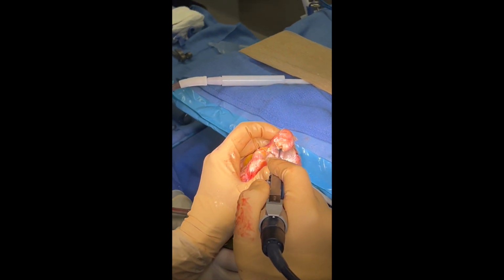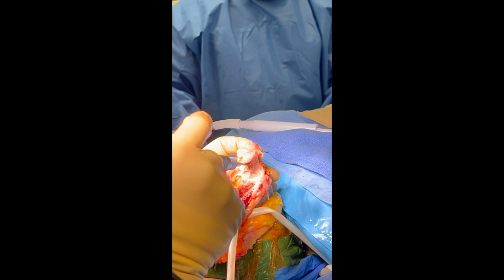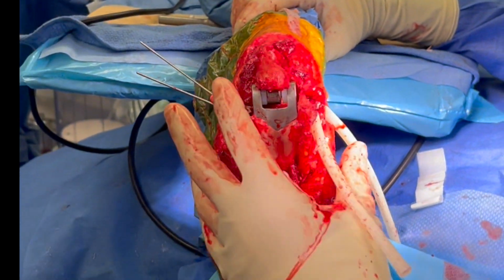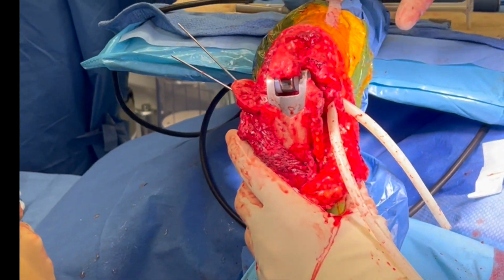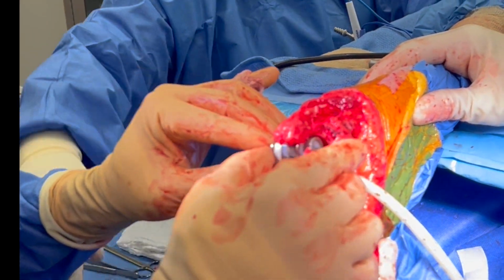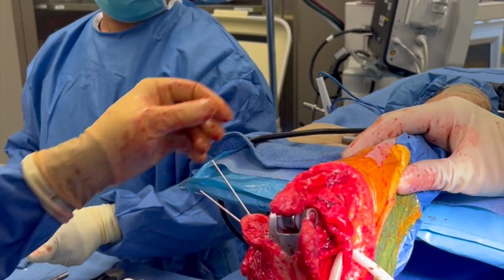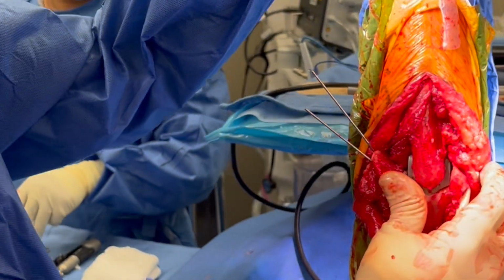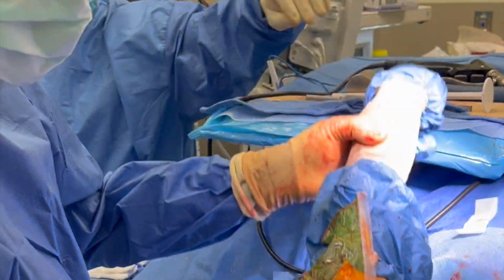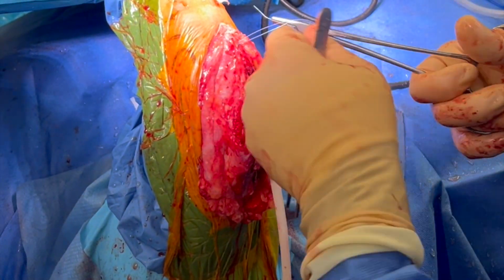Next, the ulna is prepared in a similar fashion as the humerus. Once the canals are prepared, the implant is trialed. Once the trial implants are removed, final implantation of the implants is performed using a cemented technique. Next, the elbow is taken through range of motion. There's noted to be no significant impingement.